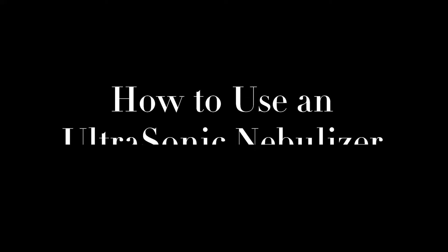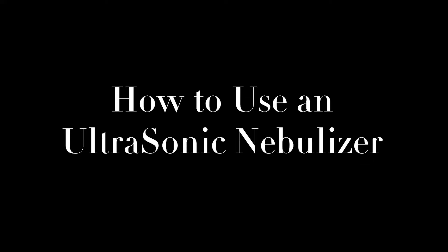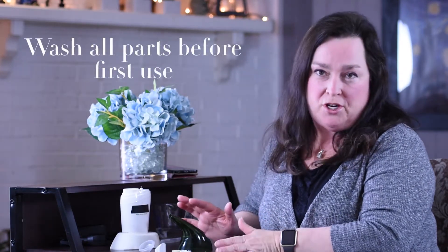This video will show you how to use an ultrasonic nebulizer. Before using this device for the first time, disassemble it and wash all the parts according to the instruction manual.